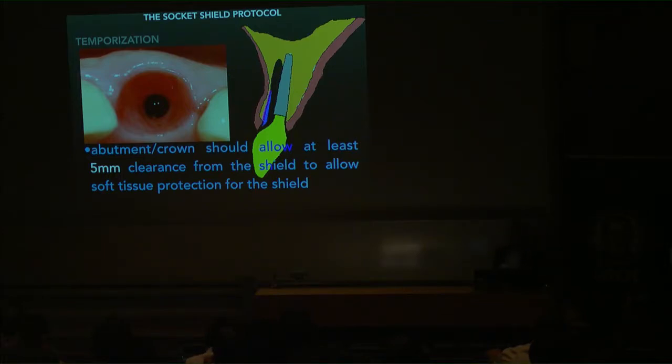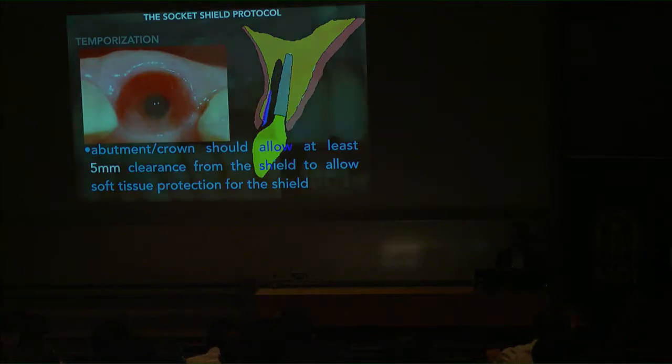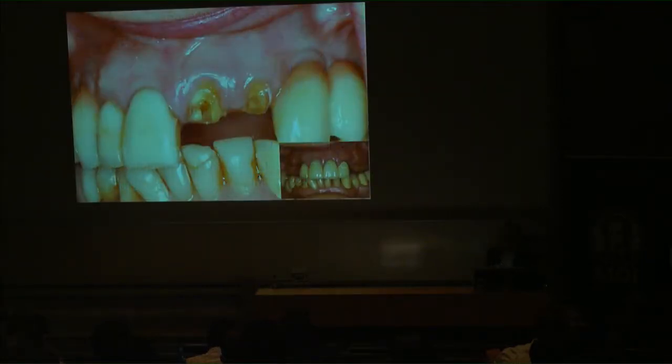I now will present some clinical cases to demonstrate the suggested protocol. The lower inset image shows the original condition of the patient seeking treatment to replace missing upper posterior teeth. Shortly after the treatment was completed, two of her crowns in front fractured at the gum line, and the situation required the removal of the root and immediate implant treatment using the socket shield procedure.